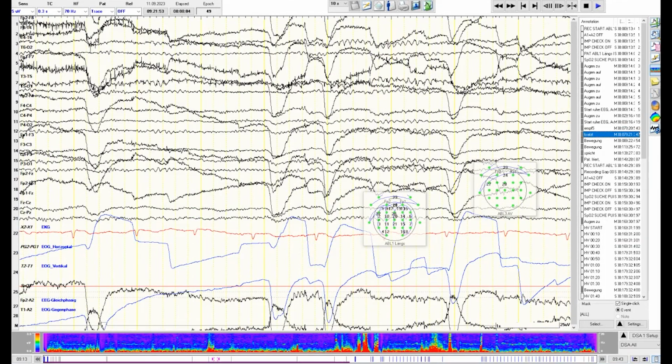No, this is no nystagmus. This is clearly just eye blinking. If you have nystagmus, it normally should be in one direction, either vertically or horizontally, and this is a clear eye shut. This is not nystagmus, where the eyeballs are just waving, but this is a real closing of the eyeball. But this is a good question, because saccades can sometimes be disturbing in the EEG. I don't know if I have an example, but these dipoles can also be artifacts. But what we see here is clearly eye closing.